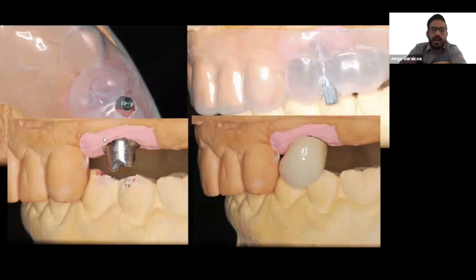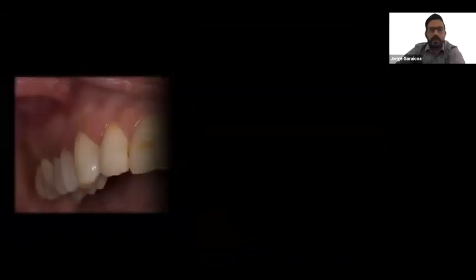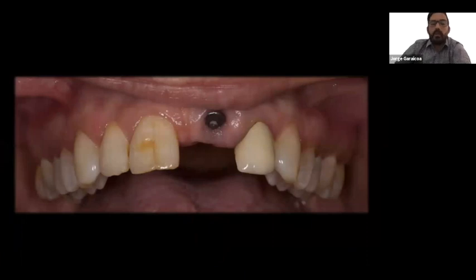Absolutely. This situation has so many problems that, with what I know now, I would probably consider removing the implant and placing it in the right spot in this particular case. It's not possible in every case, but in this particular case, because this is an old case from residency, I would probably consider just removing the implant. That's always an option, a difficult option, but an option as well.